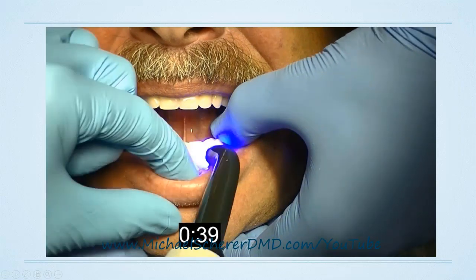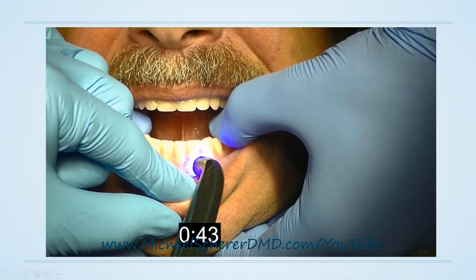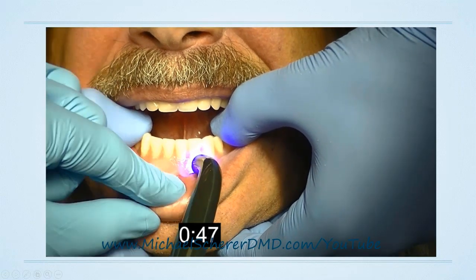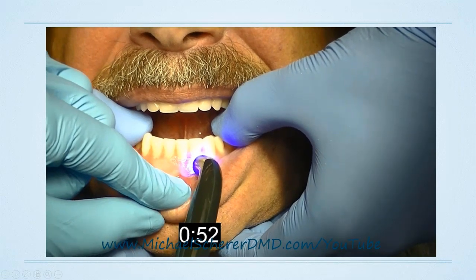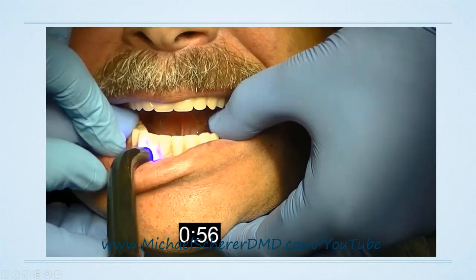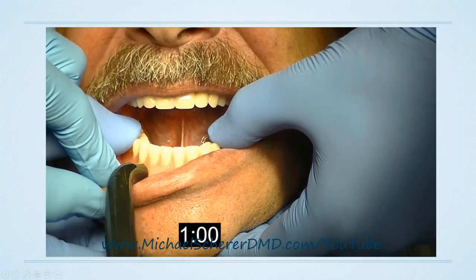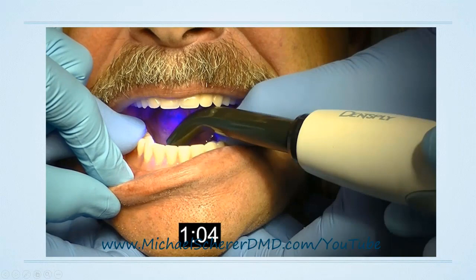So in all reality, if you have the patient bite down while this material is setting in their mouth, there's a very good chance that they're biting a little bit harder on the right, a little bit harder on the left. Maybe there's a little occlusal prematurity in your denture that you didn't know about, causing the denture to kick up a little bit off the ridge. My preference is to hold the denture down, so that I can ensure I've got a denture intimately flush to the soft tissue.